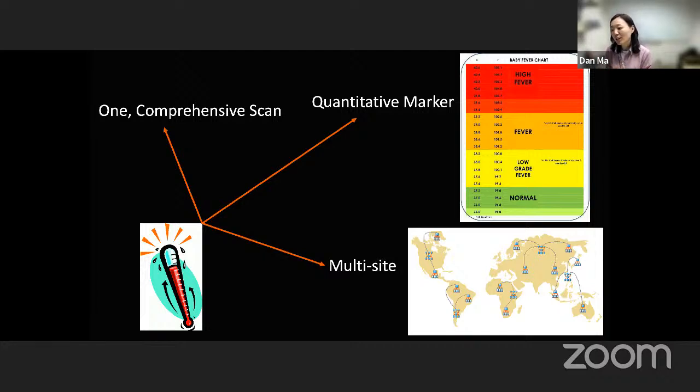This is also a challenging thing, and I think it may take some time to build up the clinical evidence to show that quantitative MR is a clinically high need, because adding even 5 minutes needs some justification, not to mention adding 5 minutes for all the patients. So that's the clinical translation side.